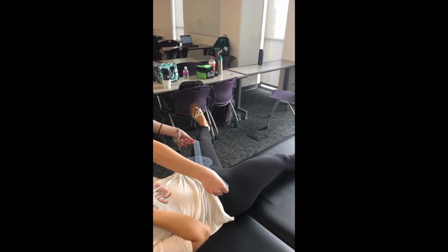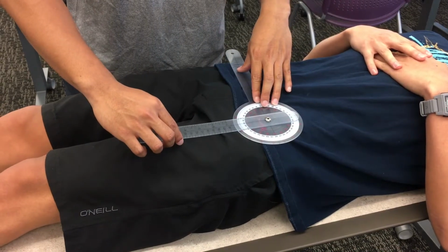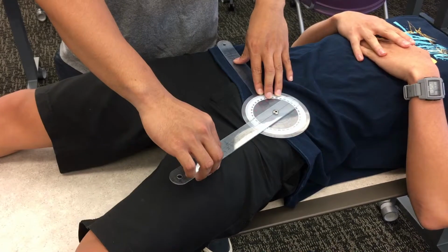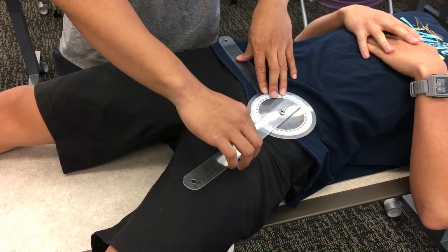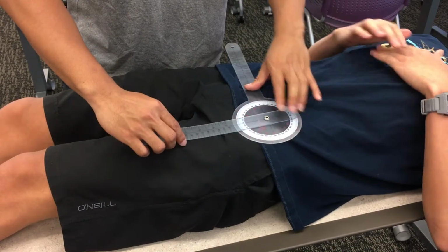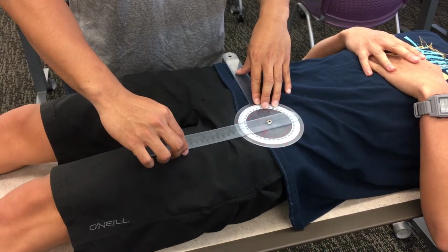The stationary arm is an imaginary line from the ASIS to the other ASIS. The mobile arm follows the midline of the femur, and the axis of rotation is the ASIS. The muscles causing the action are the glute max, glute medius, glute minimus, TFL, and sartorius.